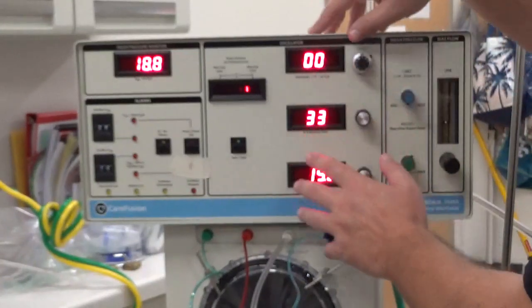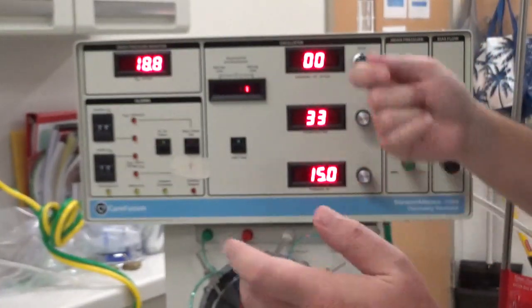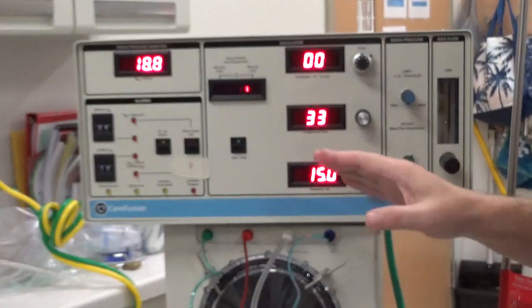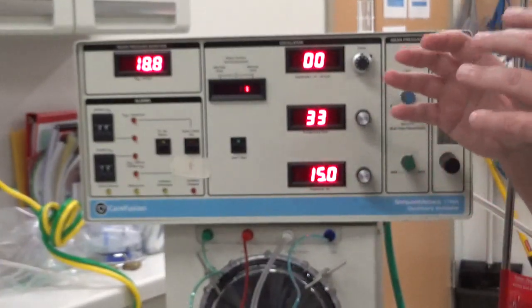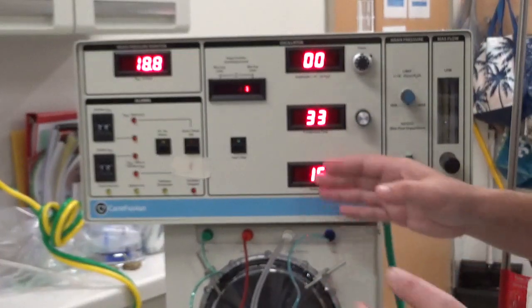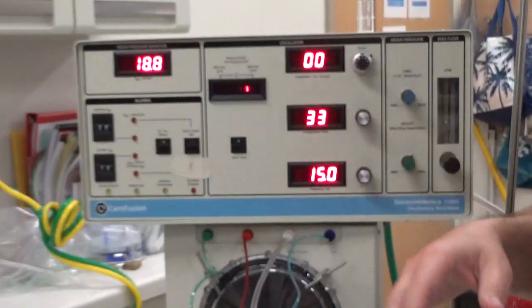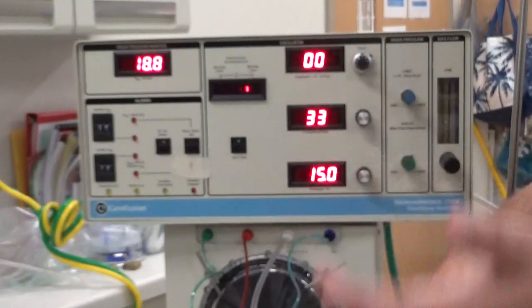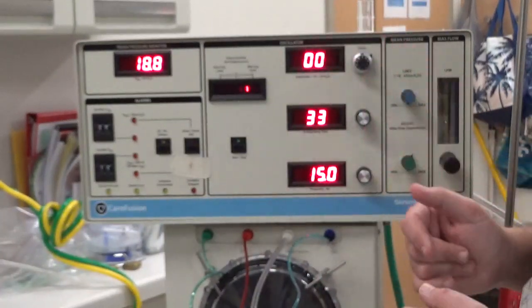So to get rid of CO2, we would want to turn up our amplitude, in other words, synonymous with turning up our PIP. However, on an oscillator, when we want to get rid of CO2, we actually want to go down on our rate. So let's say we were on a hertz of 15 and we want to get rid of CO2, we'd actually want to go to 14. Like if you were on 10, you go to 9, and you wouldn't go to 11.